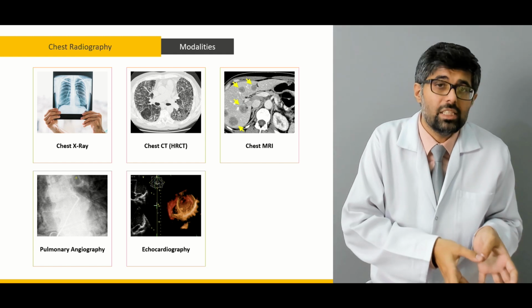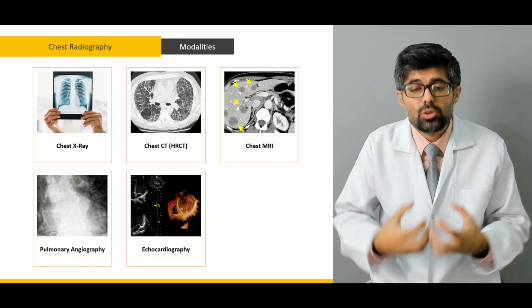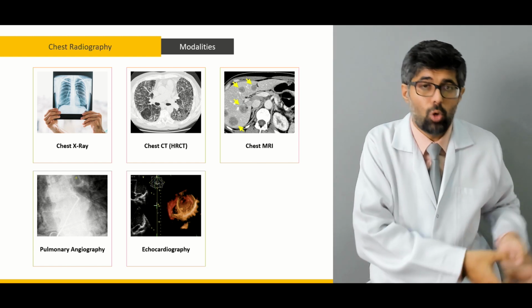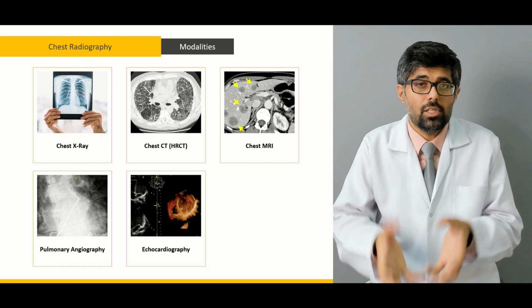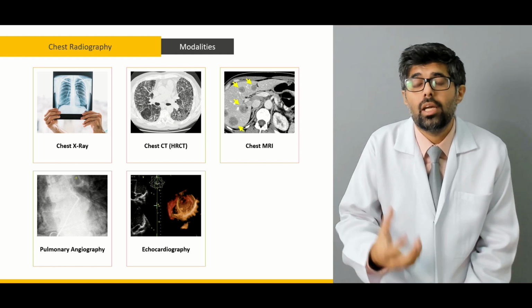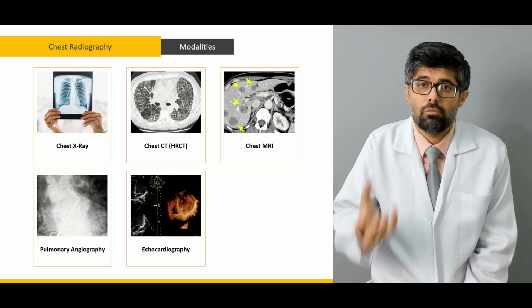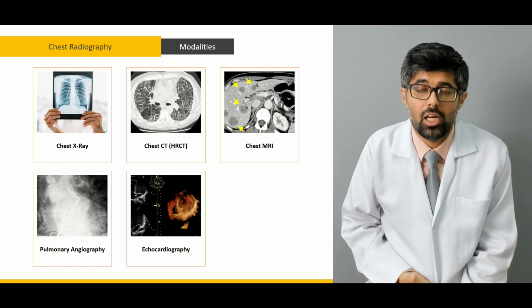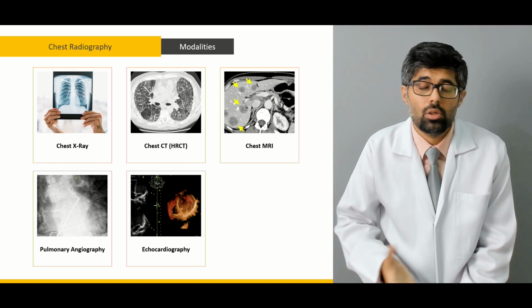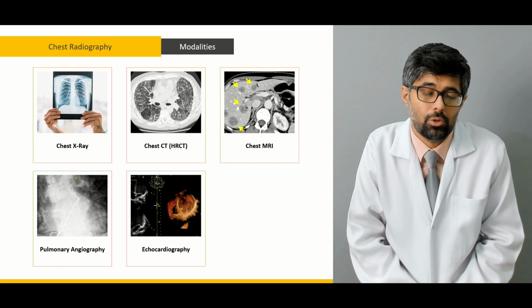shown on the echocardiogram. Not only that, but we can also judge both the volumes and the working, or you can say the tonicity of the ventricles. If the muscles are dilated, if the muscles are not, whatever the case is, we can diagnose this on echocardiogram.